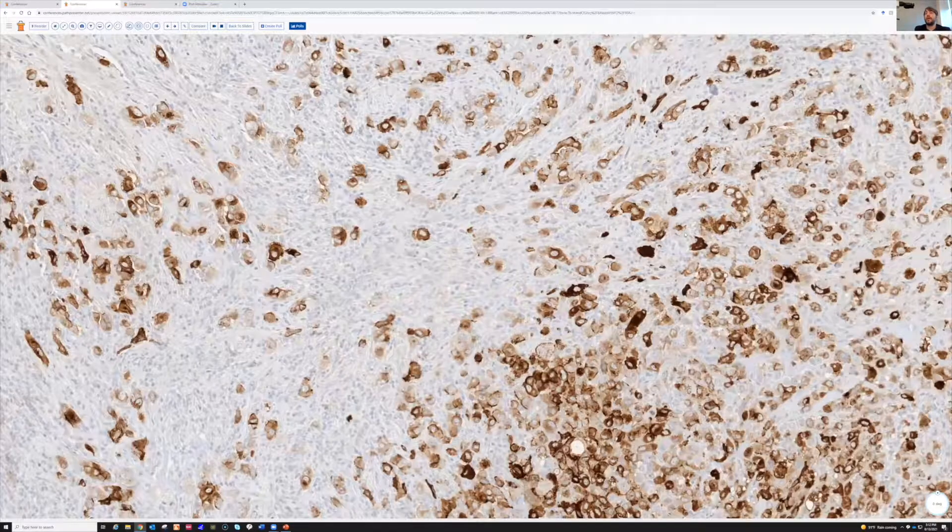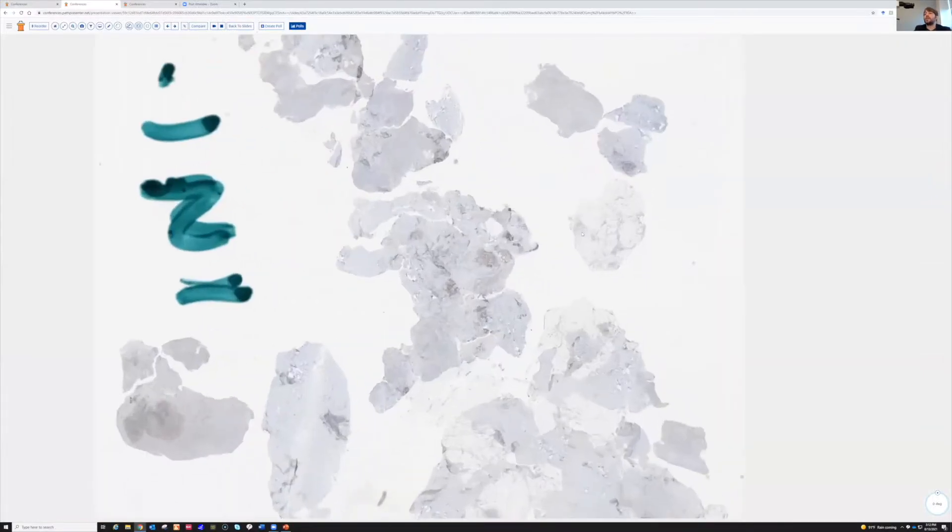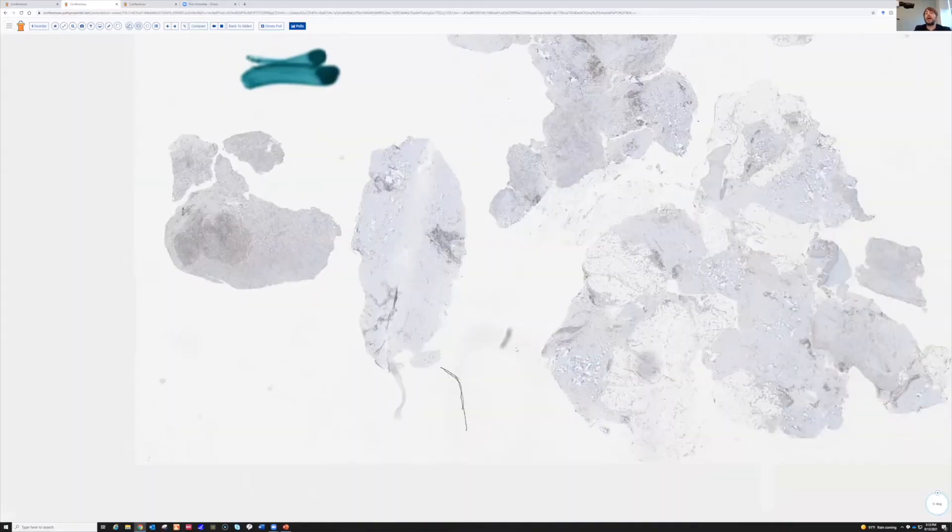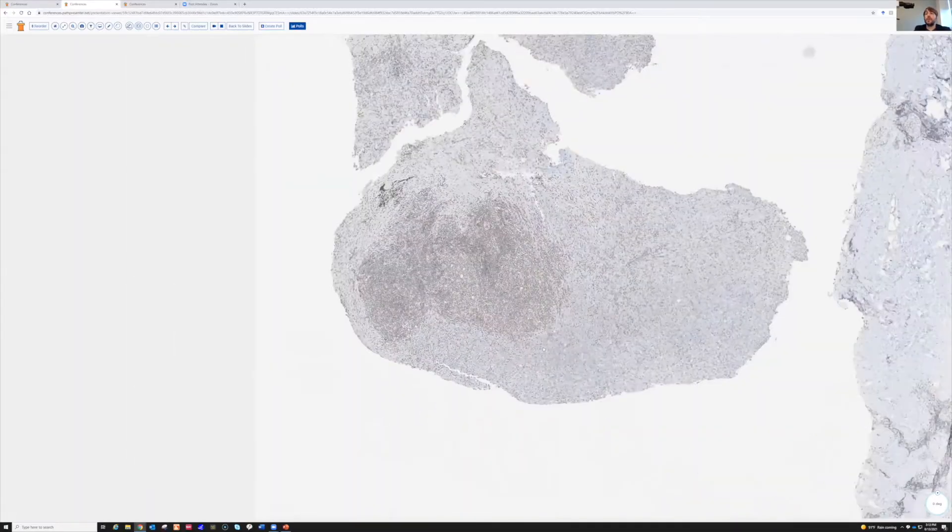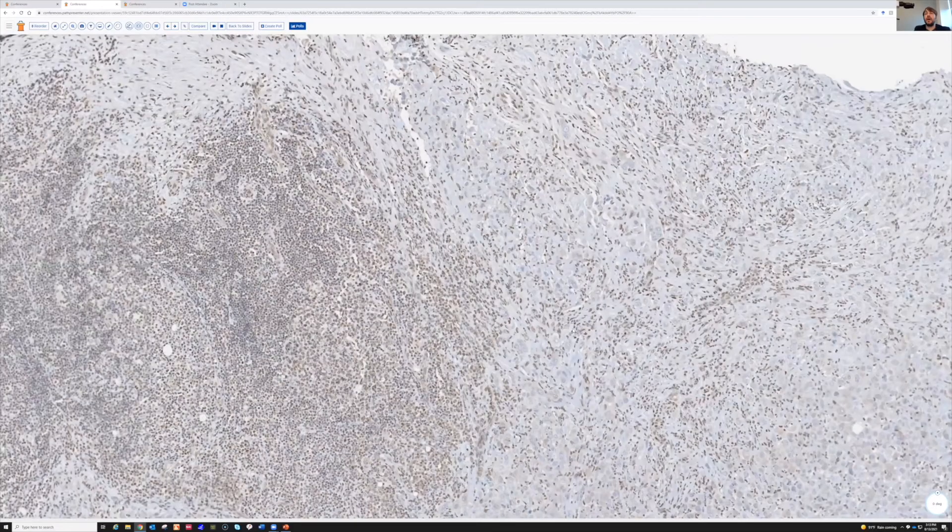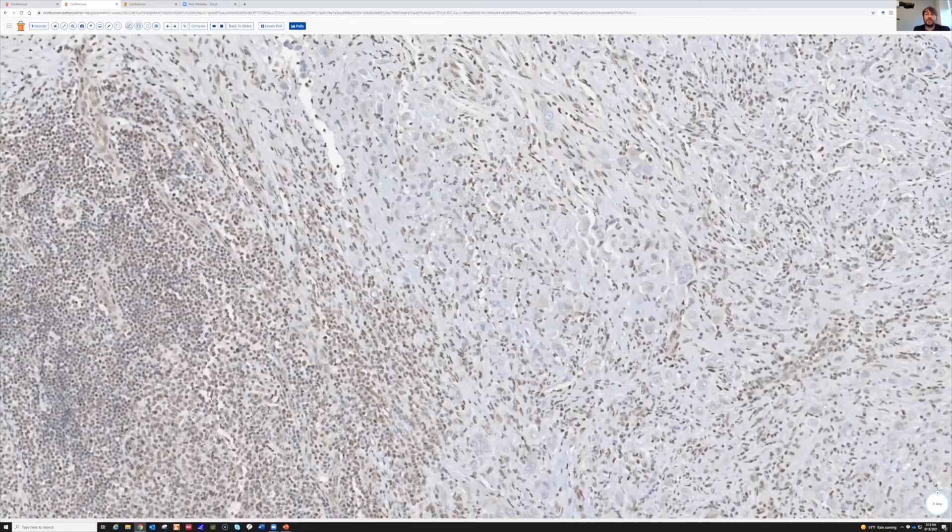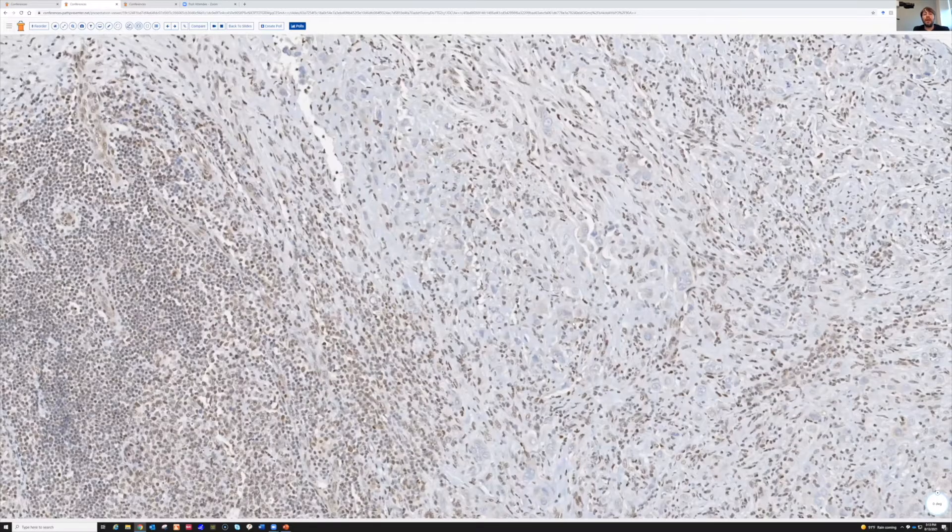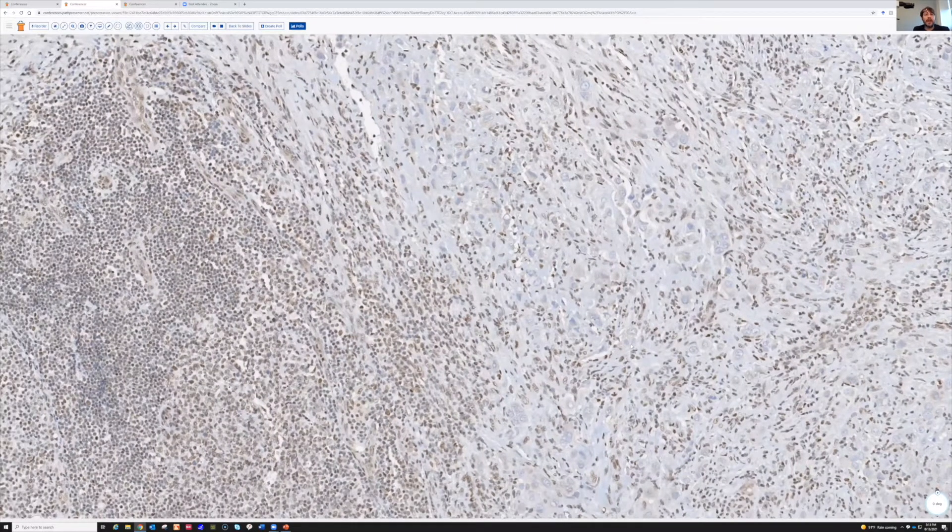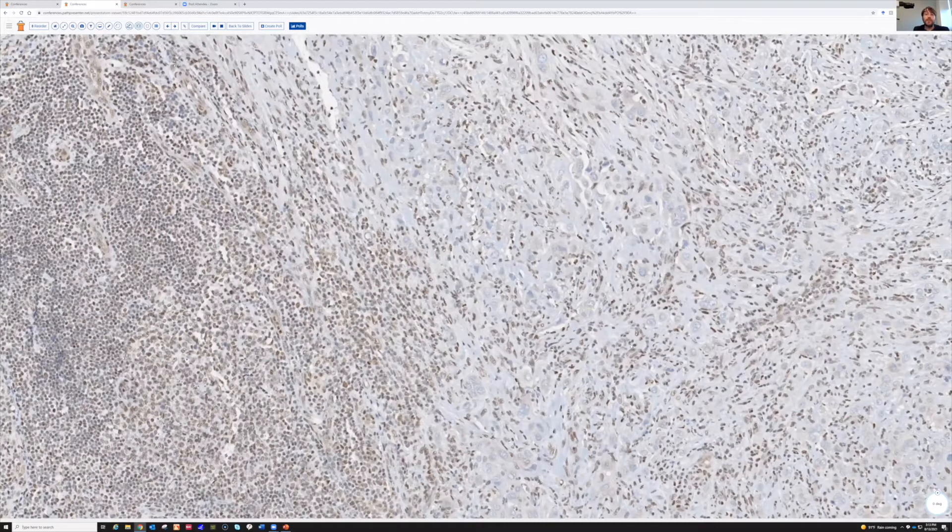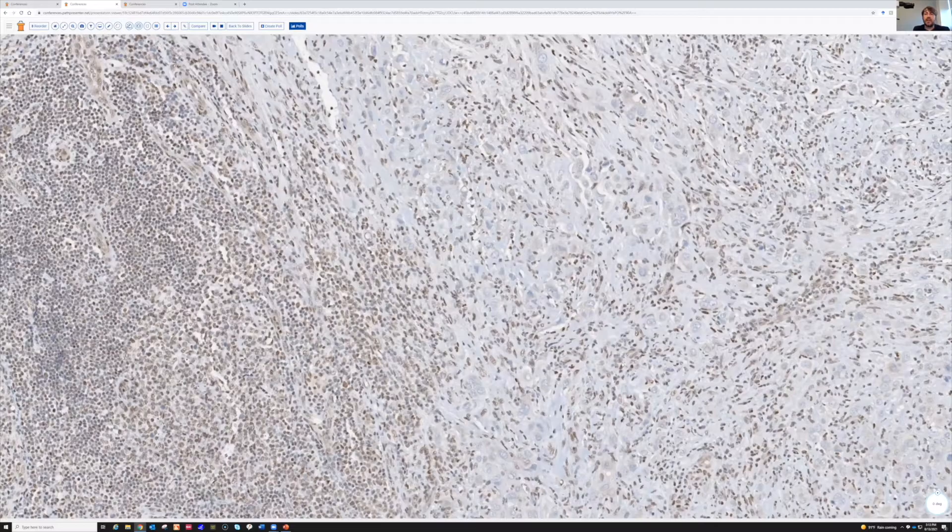And then further support, this is INI1, also known as SMARC-B1, and you can see this is one of those stains where negative staining is what matters - loss of expression in the tumor nuclei. Whenever you have one of those stains, whether it's one of the microsatellite instability markers or whatever, you have to make sure your internal control worked really well, because otherwise if the stain fails, you could inappropriately consider that to be a loss of expression and make the wrong diagnosis.